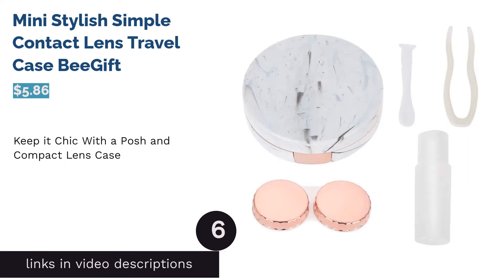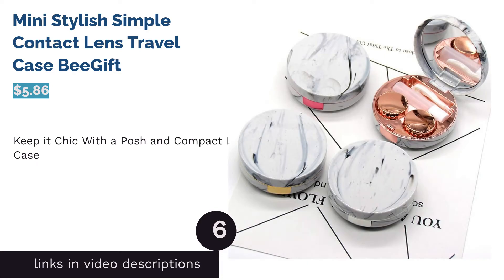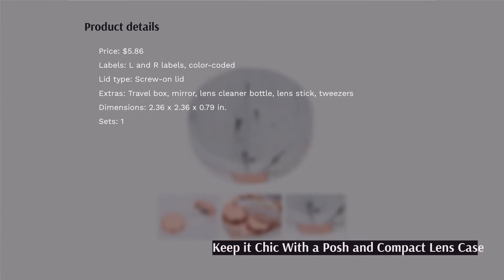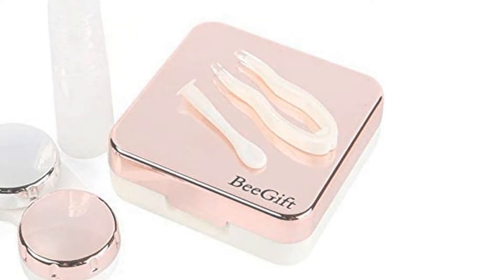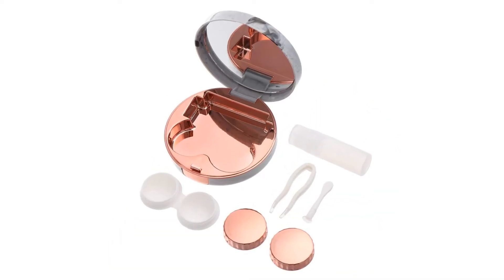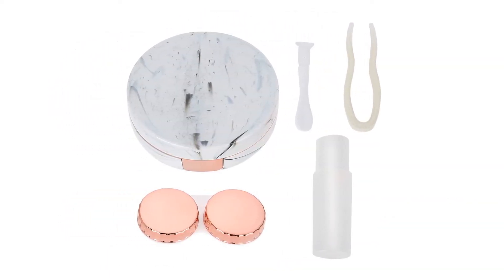The next product in our list is the Mini Stylish Simple Contact Lens Travel Case by Be Gift. This contact lens case comes in a chic shiny compact with a mirror and other accessories. The square kit comes with extras that make wearing or removing your contacts something you can do no matter where you are. Besides a sleek matching contact lens case, the kit gives you a mirror, a lens cleaner bottle, a lens stick, and tweezers — all fitting in one small kit. The actual lens holder has color-coded L and R labels.